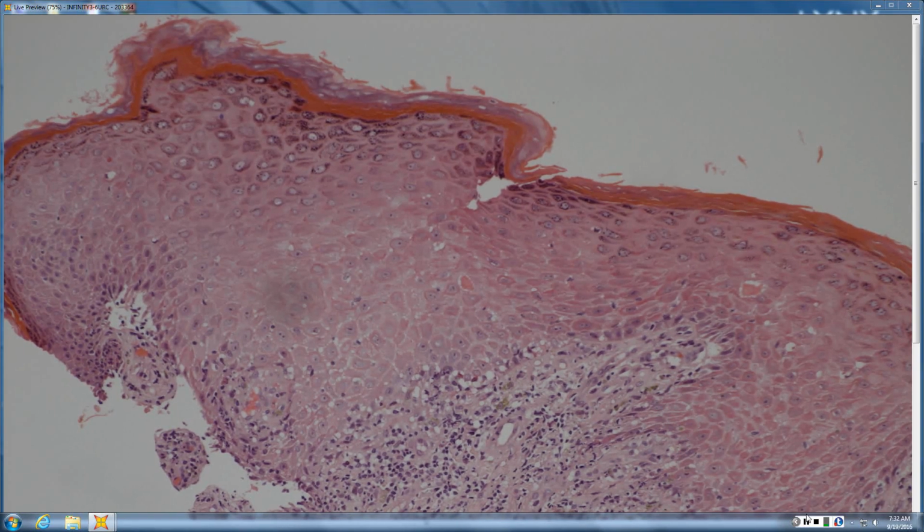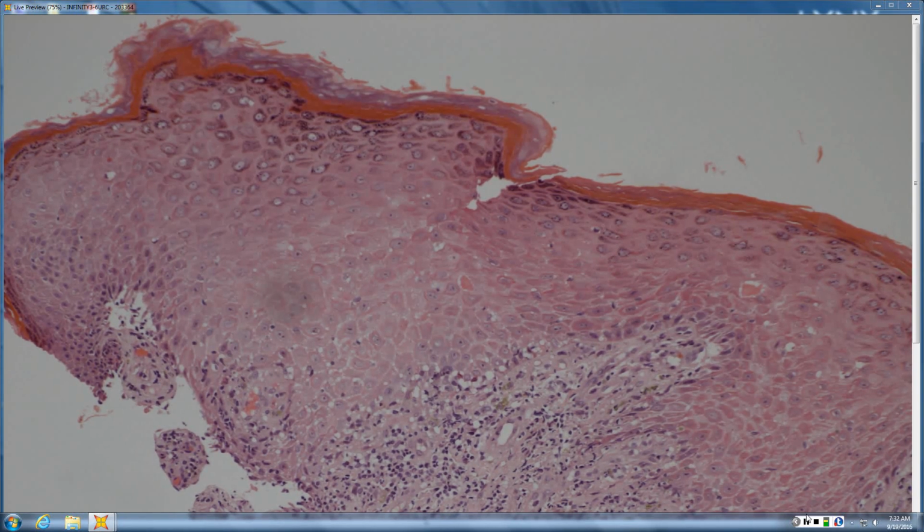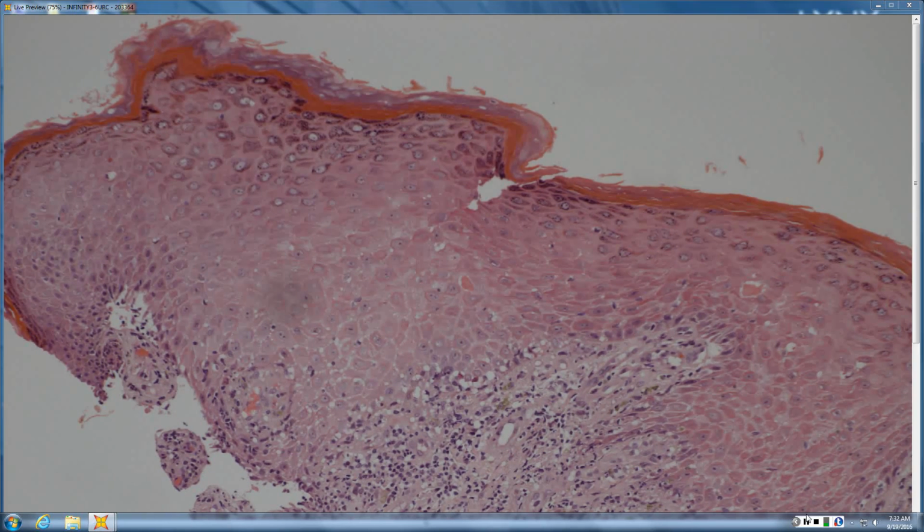So, given that this one is lichenoid, what's your differential? LP for this one. Could have also in the differential VLK, lichenoid GVHD, sometimes hypertrophic lupus. Two more, I think you left out lichenoid drug and lichenoid regression of melanocytic. Well, I wasn't considering lichenoid drug for this one because it doesn't have the other things that go with that. But I guess it can not have the parakeratosis thing where you can tell.